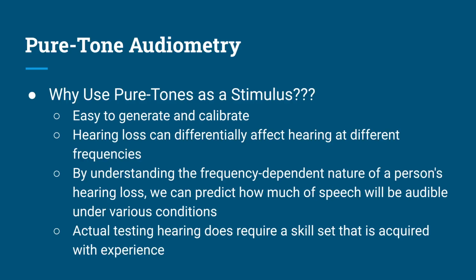By understanding the frequency-dependent nature of a person's hearing loss, we can predict how much of speech will be audible under various conditions. So like I said, we're not measuring hearing under realistic circumstances, but we can make predictions based on pure tone audiometry, even though it's not what we're actually measuring. Actually testing hearing does require a skill set that is acquired with experience. You're going to get better at testing as time goes on. You're not going to be an expert at it right away.